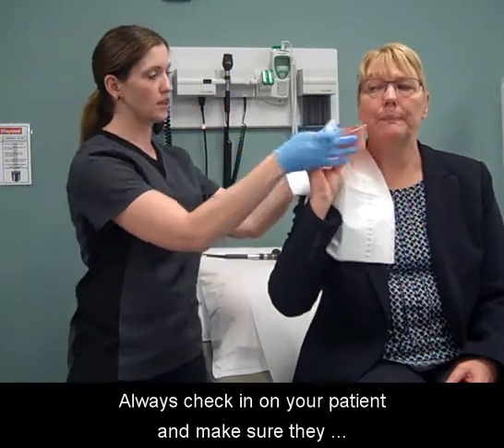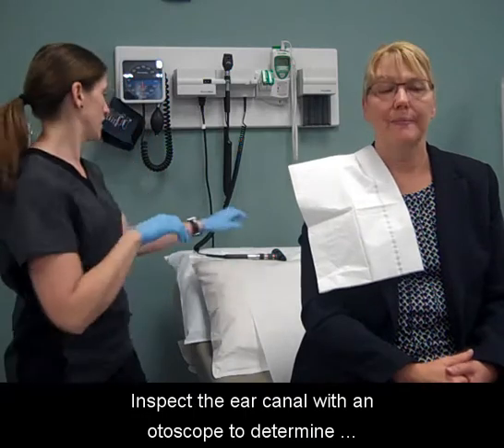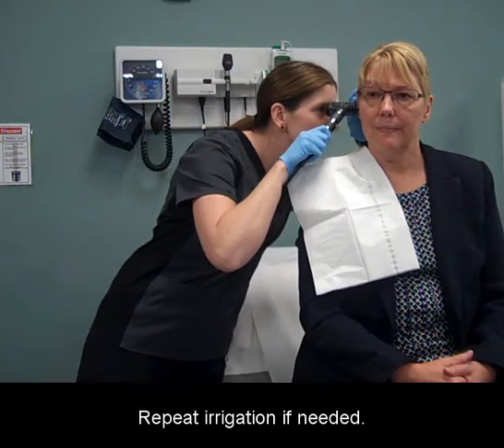Always check in on your patient and make sure they are feeling well. Inspect the ear canal with an otoscope to determine whether the desired results have been obtained. Repeat irrigation if needed.